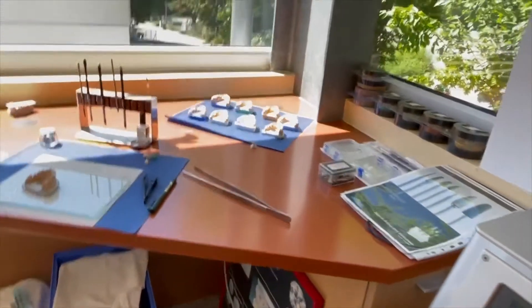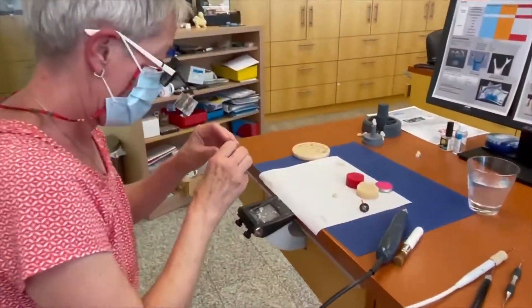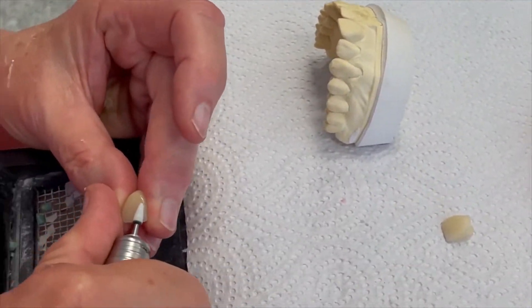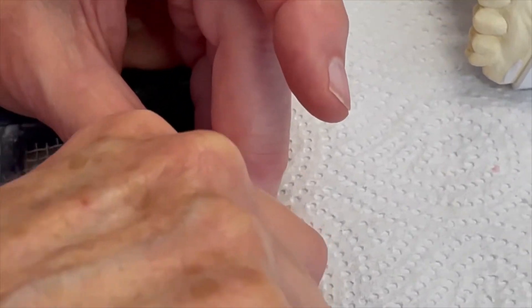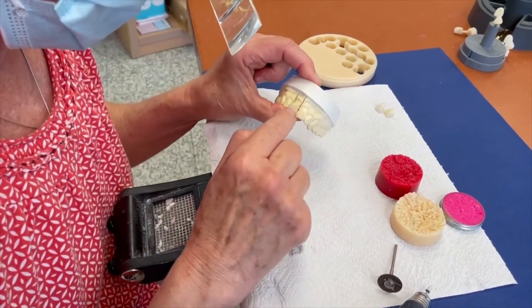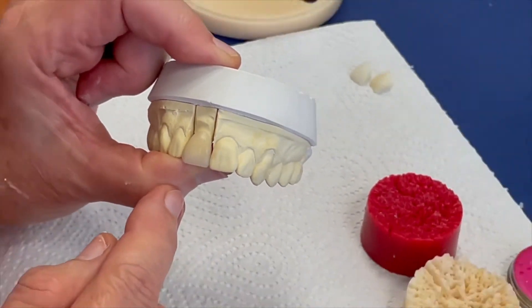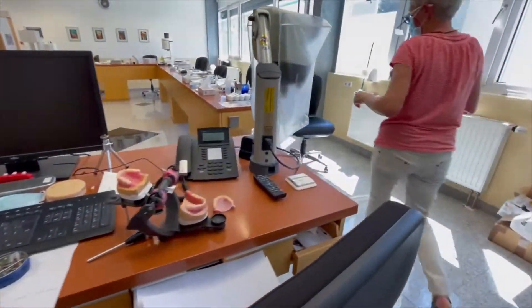To glaze the crown, we have to change places once again because she has to grain it a little bit. The crown is on the model and the graining is done. Now you see it on the model. We will move to our ceramic place because there Andrea will do the last steps with the glazing paste.